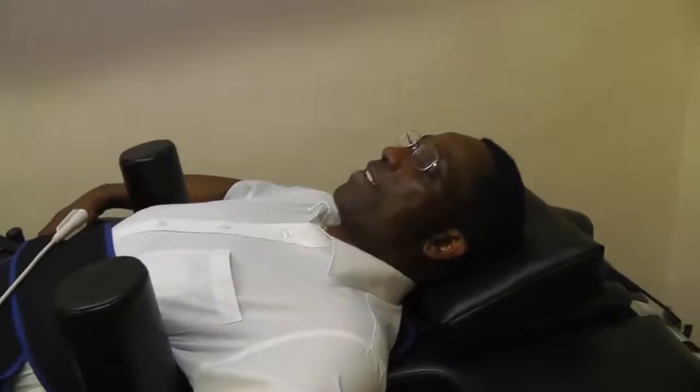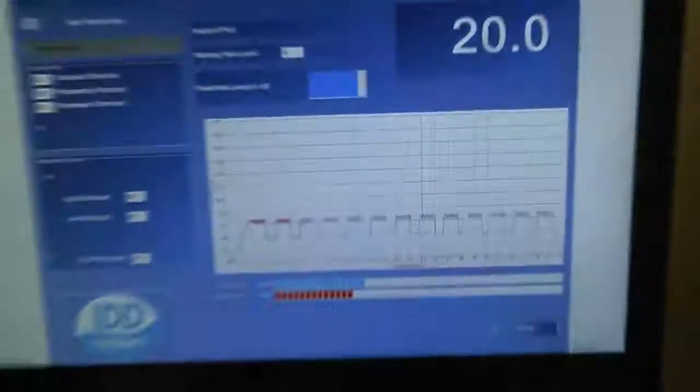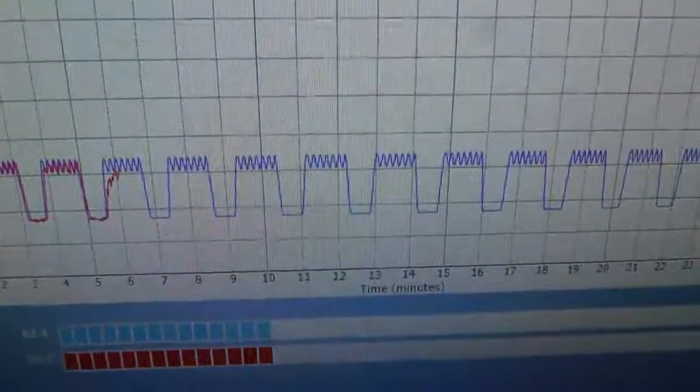As the tension comes on that's beginning to open up — can you feel that stretch? It is stretching, so that's a deeper stretch, is it John? It is, and I feel it working. So that's opening the space. Over 26 minutes — you can see it on the tracking there — he's going to have 13 of those stretches.